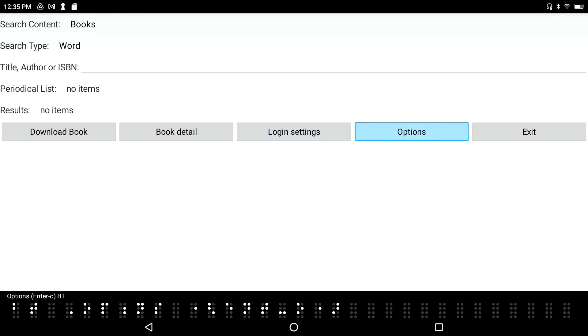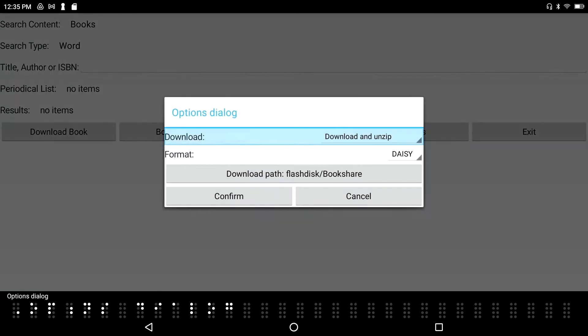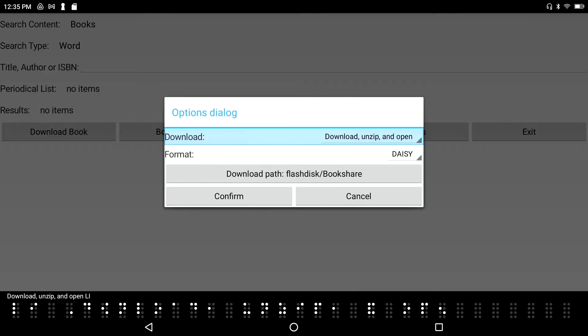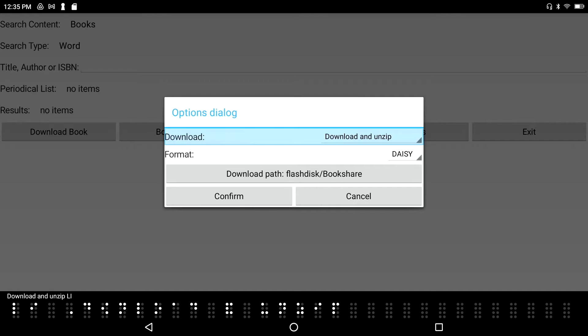I've got some options here. I'll press enter to go in. I've got some choices here: I can download and unzip, download unzip and open, or I can download without unzipping or extracting. More often than not, I'm going to want it to download and extract so I don't have to go through that extra step. I don't want it to open up the book in the Daisy book reader because I might just be on a hunt for new reading material.